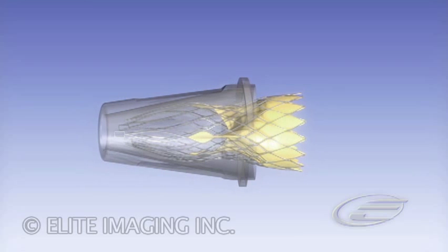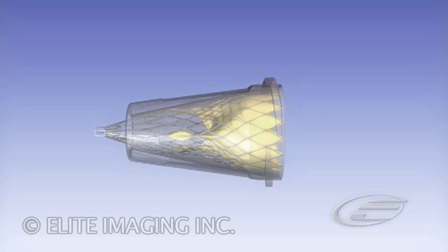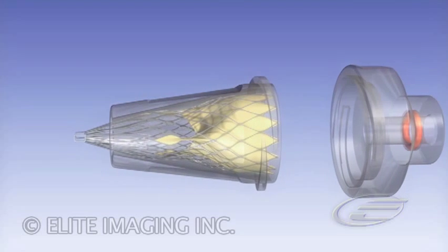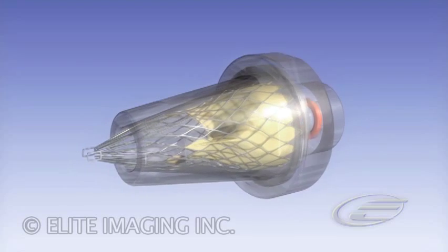Continue to slowly insert the frame into the outflow cone. Make sure that the frame is completely within the outflow cone. Secure the outflow cap to the outflow cone.